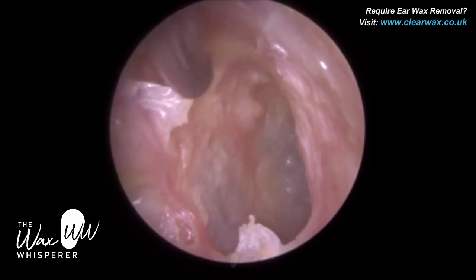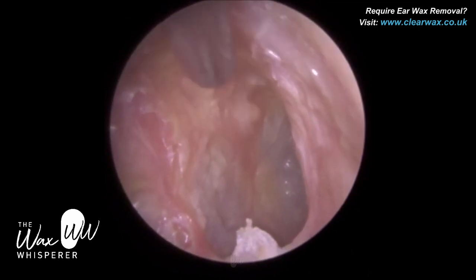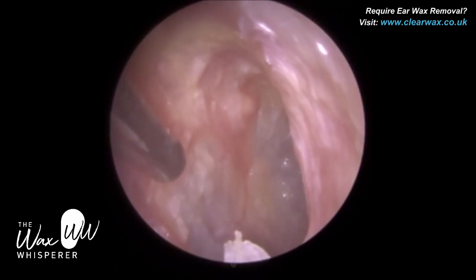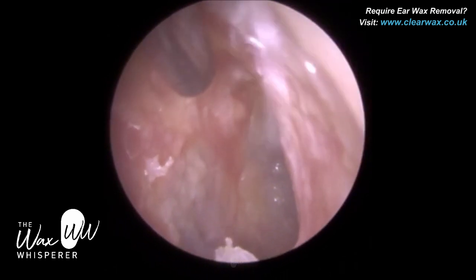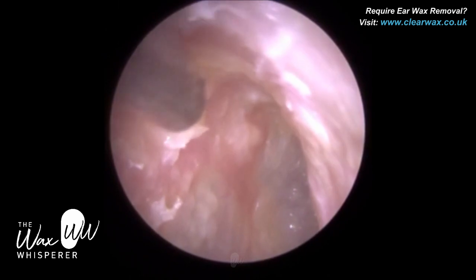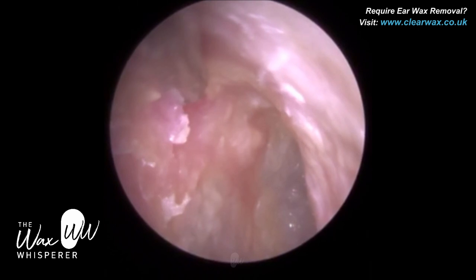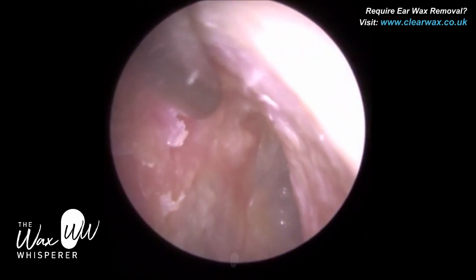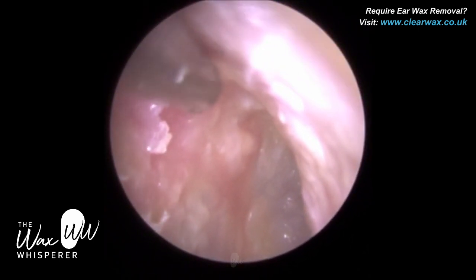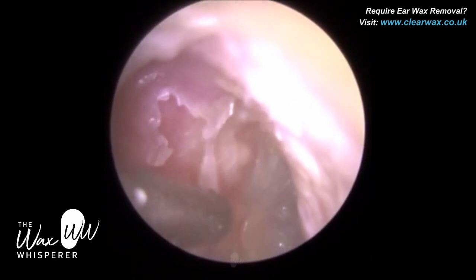I'm just peeling some dead skin off the posterior canal wall. We are on the bony part of the ear canal now, so we have to be extremely careful. A lot of people comment asking why I don't use hooks and scoops on the canal wall. I can guarantee that in those videos where you see hooks and scoops used against the bony canal wall, the patients either have local anesthesia or general anesthetic. There is no way a patient without anesthesia would be able to tolerate direct contact with the bony canal wall — it's just so uncomfortable.